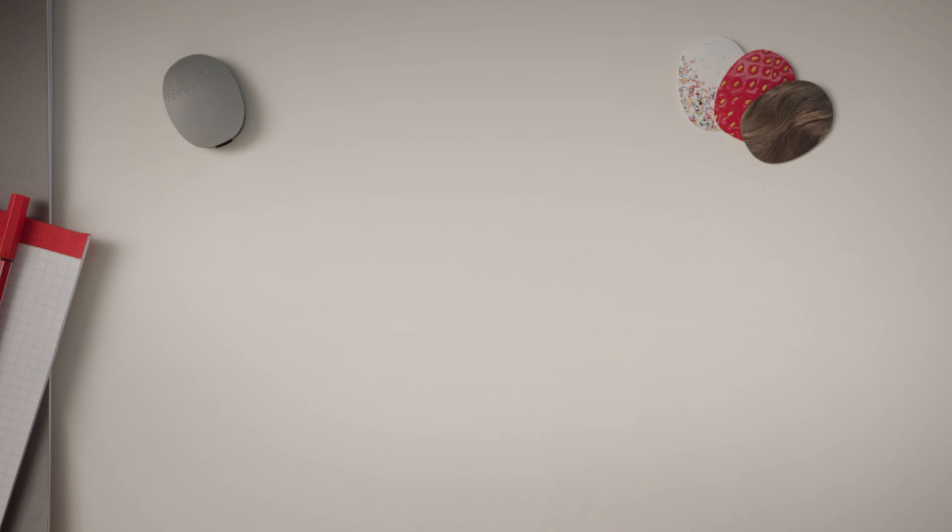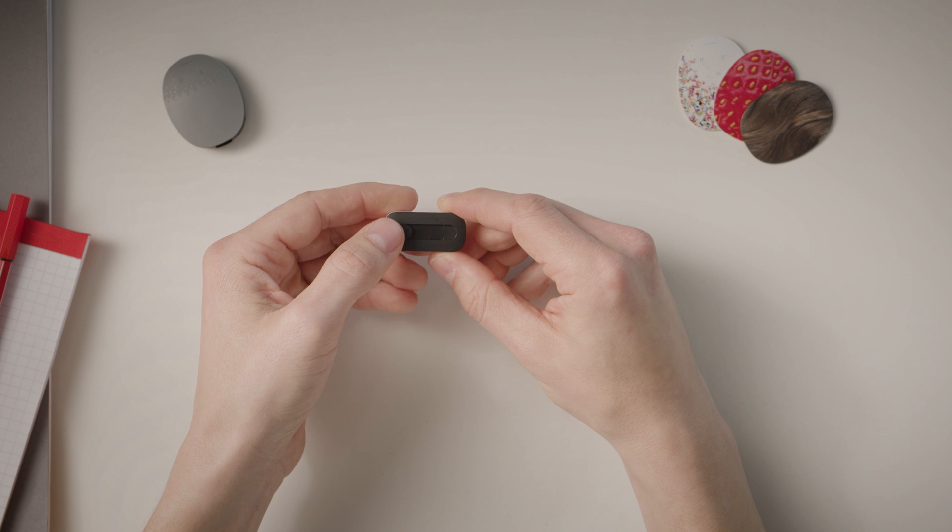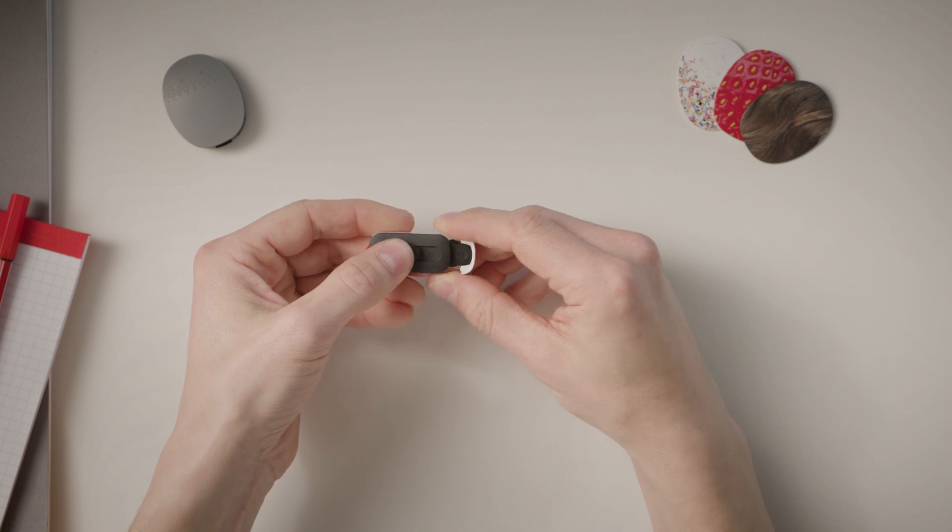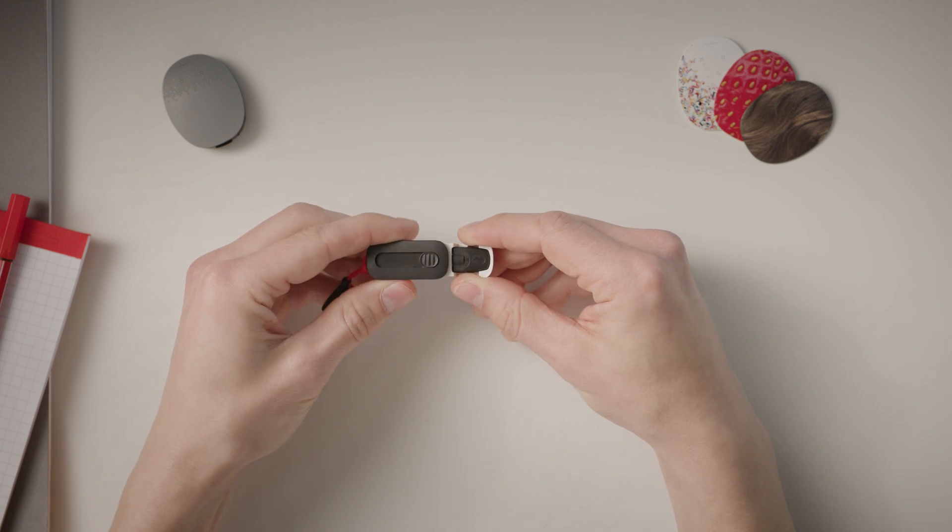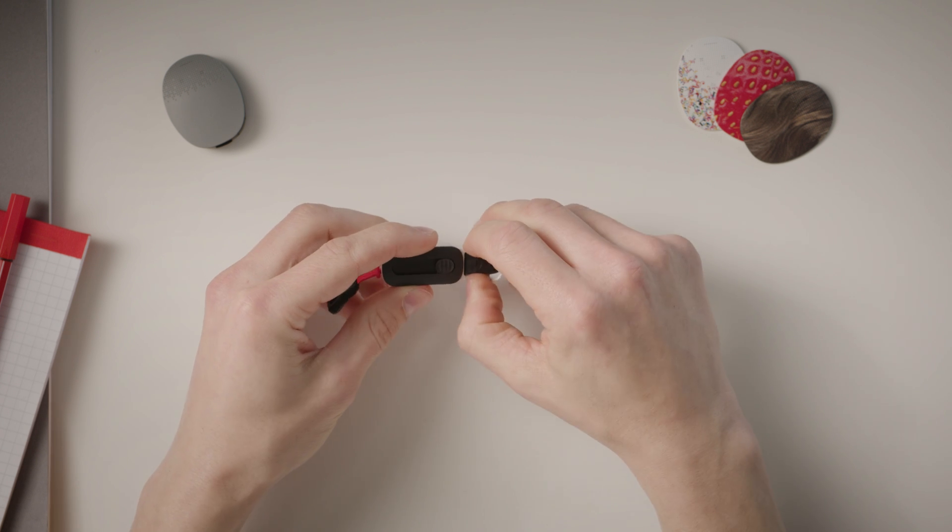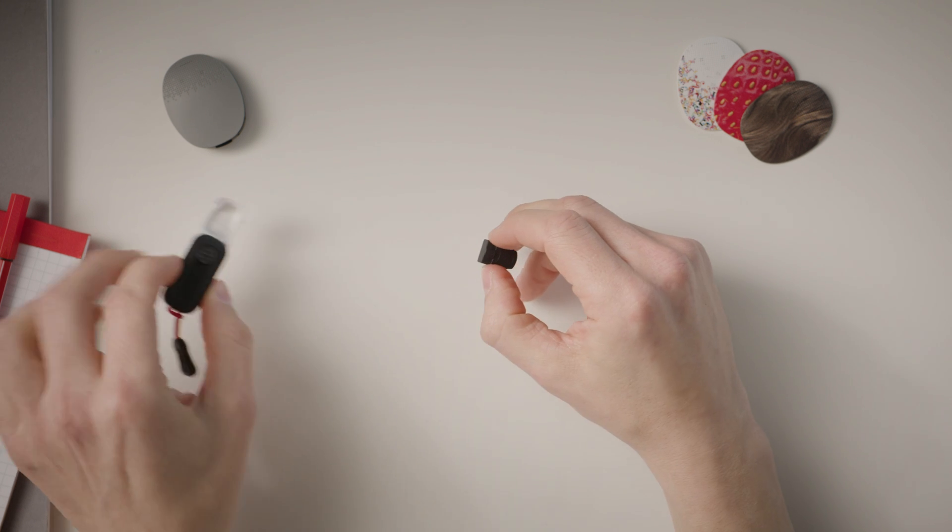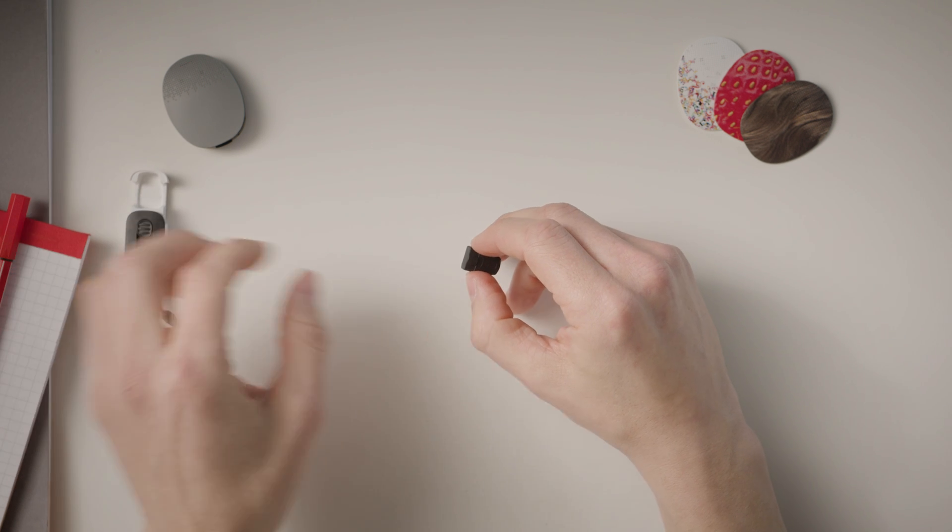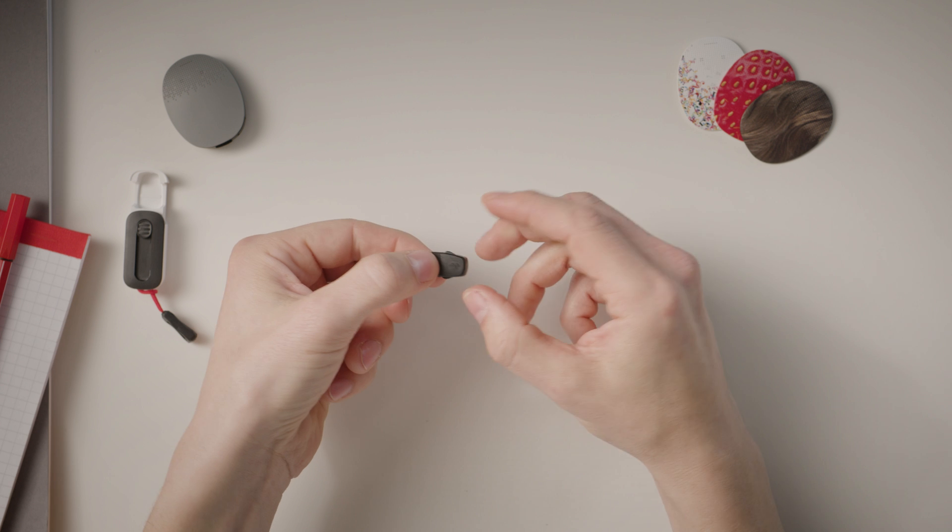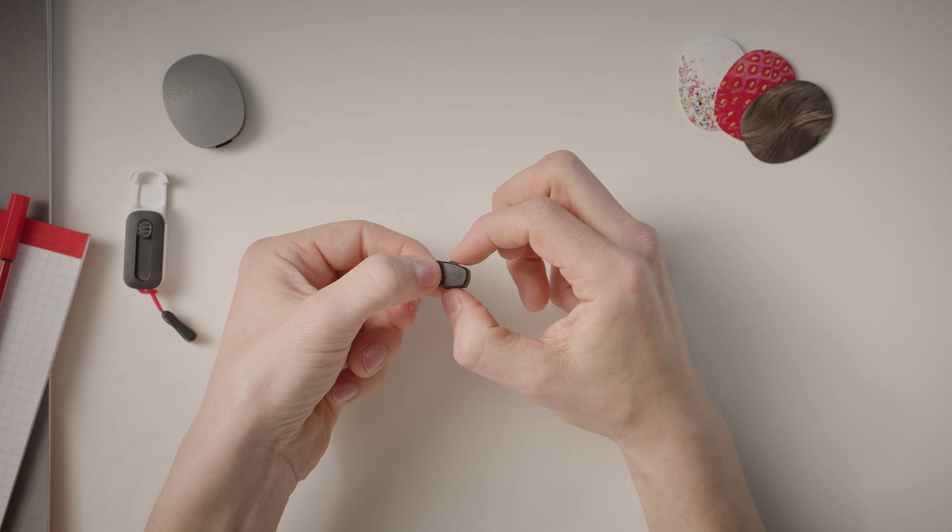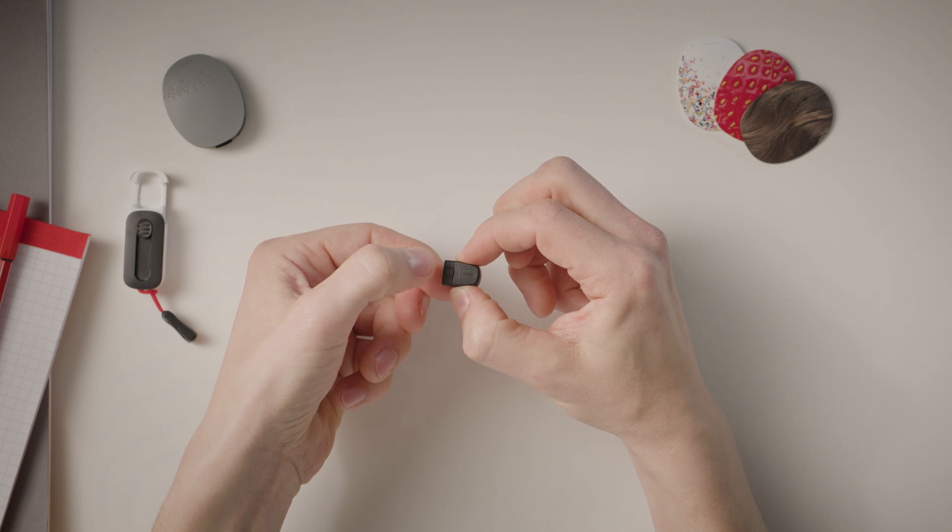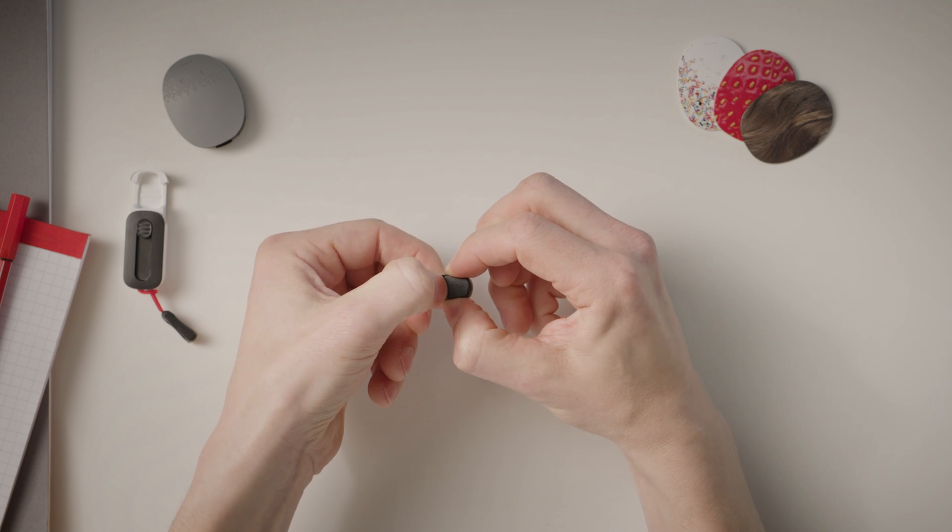First up, how to assemble it. To assemble the AudioStream adapter, remove it from its case and carefully take off the rubber cover by pressing the levers on the adapter.